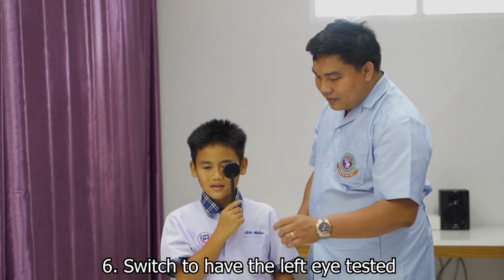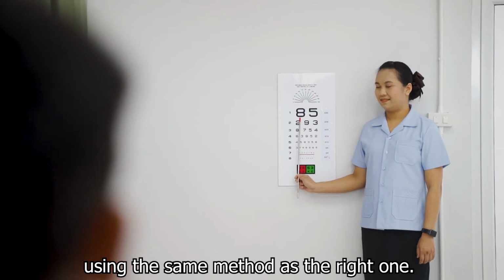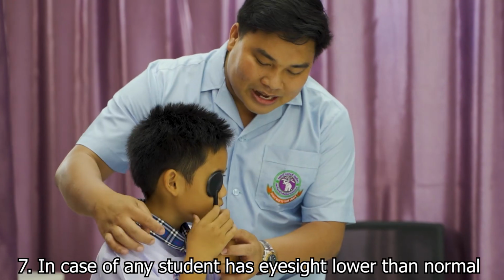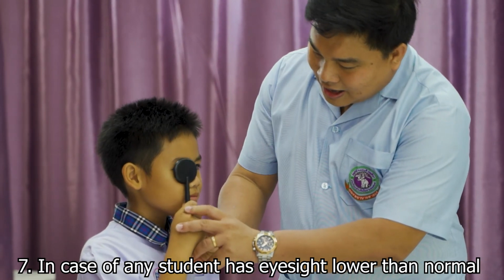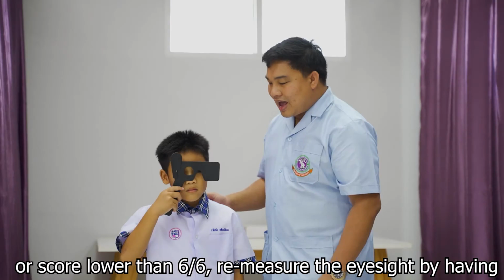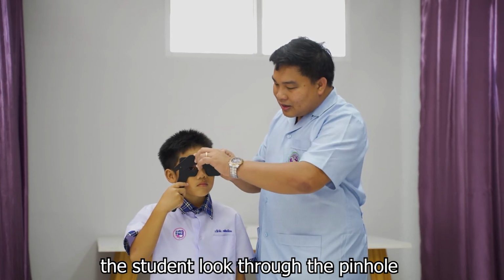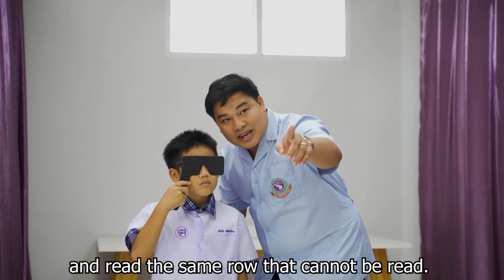6. Switch to test the left eye using the same method as the right one. 7. In case any student has eyesight lower than normal, or a score lower than 6/6, we measure the eyesight by having the student look through the pinhole and read the same row that could not be read.